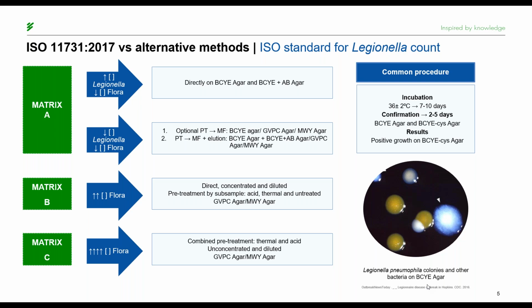In microbiology, when we talk about traditional techniques, it is known that culture media have been the standard for decades. And this technique continues to dominate the sector.